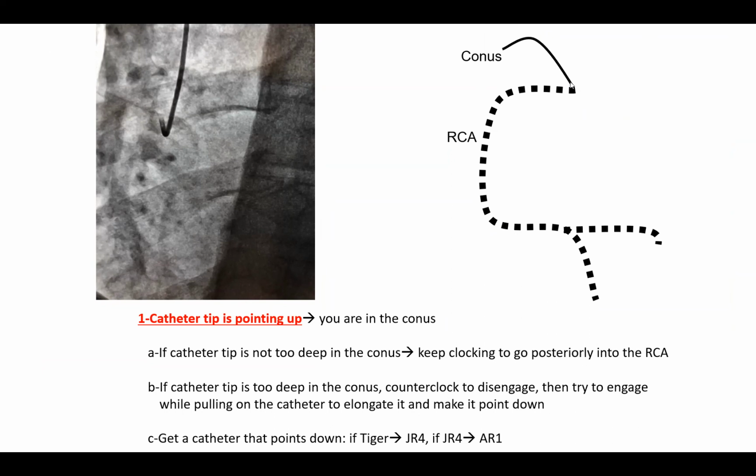The catheter is occluding that conus. So the dye will stain, will hang around, will not clear. It will cause myocardial stain and subsequently ventricular fibrillation. So you will definitely cause ventricular fibrillation if you inject while in the conus.